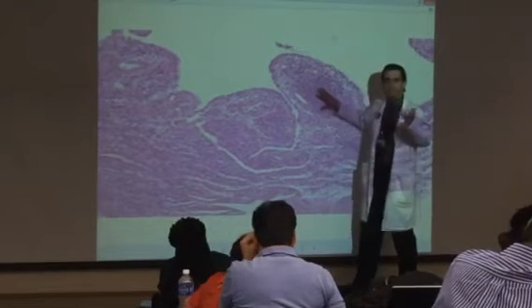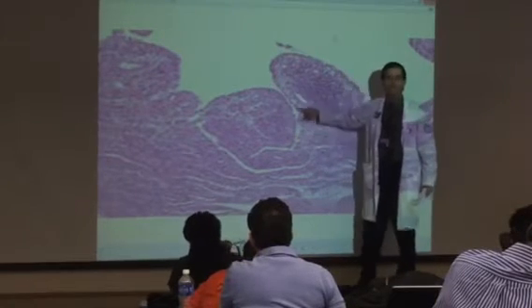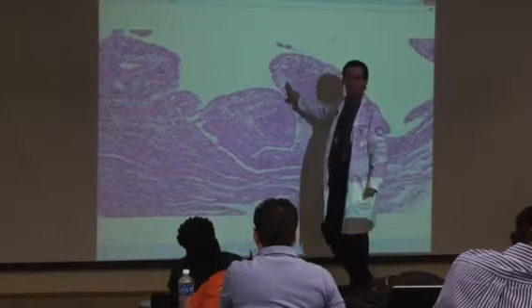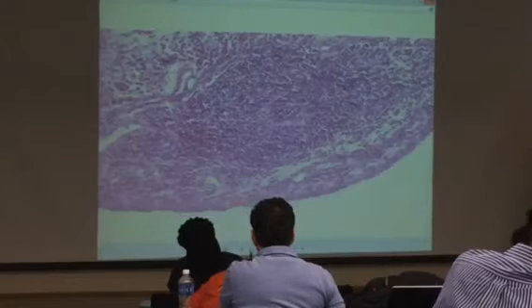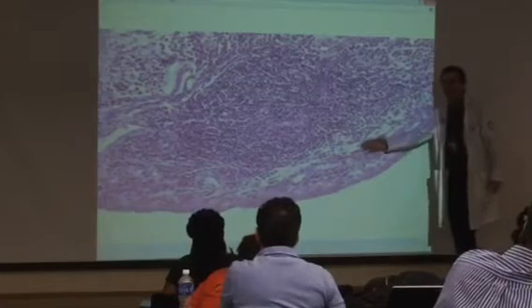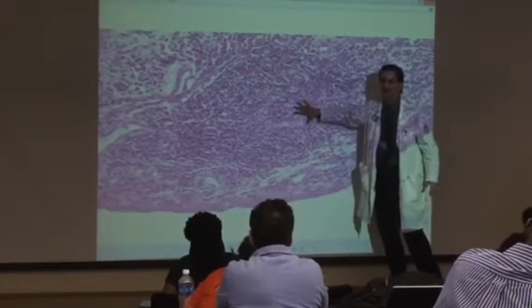Remember T cells, plasma cells. Actually, this is an aggregate of T cells. We call this pannus. Pannus is one of the hallmarks of rheumatoid arthritis. It's one of the causes of the damage to the cartilage, these inflammatory cells and pannus. So if somebody asks, what is the pannus? It is hyperplastic synovium that is raised inside the joint and contains all these inflammatory cells.